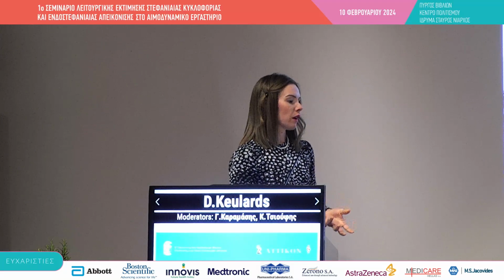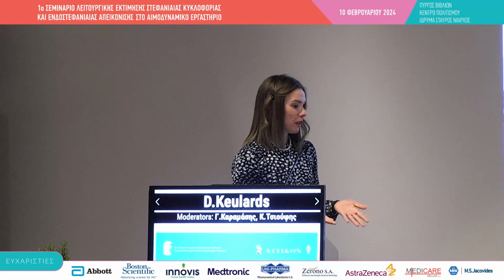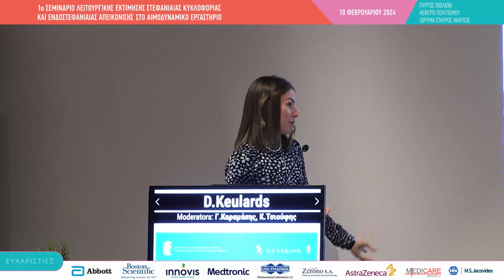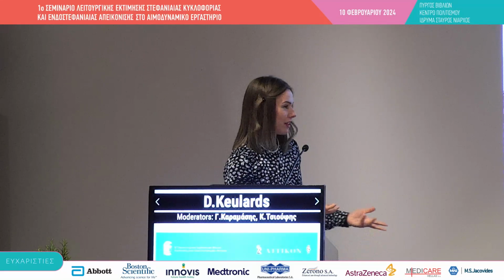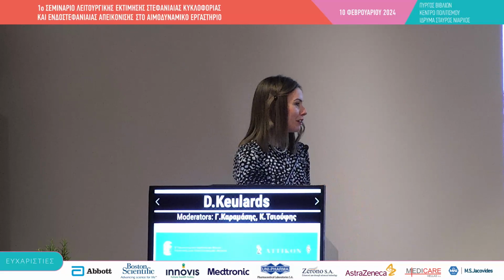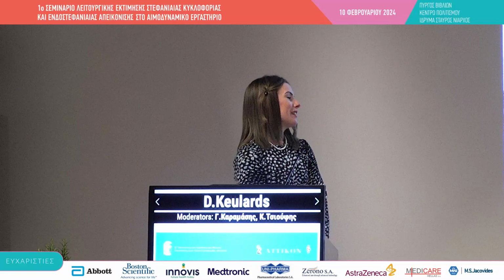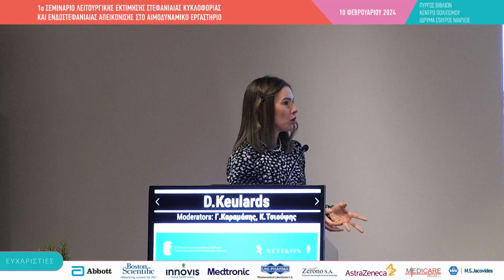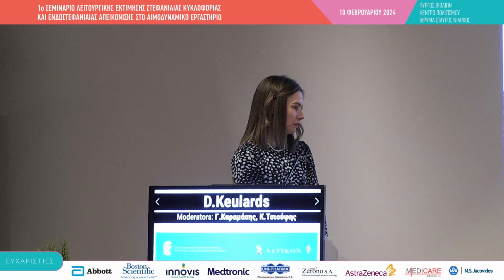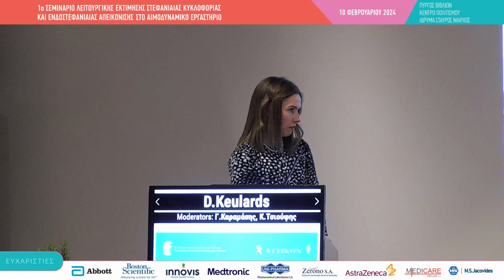And that's also the reason why we still measure both, because continuous thermodilution is still in its baby shoes. We're running 20 years behind on IMR because that was invented in 2003. All new techniques need 10 to 20 years to become popular. So we're always measuring both to see whether the values point in the same direction. So continuous thermodilution then is more reliable.